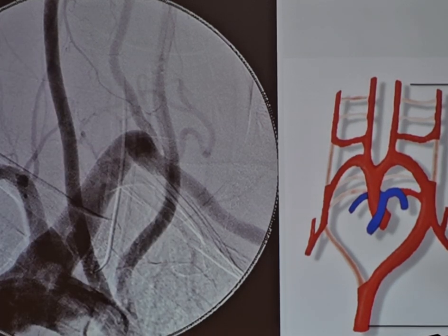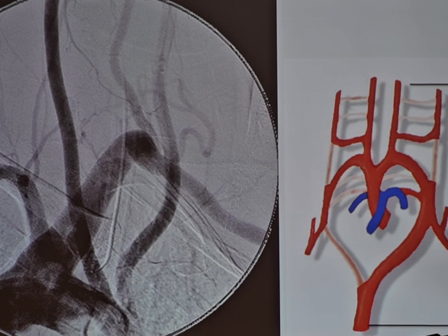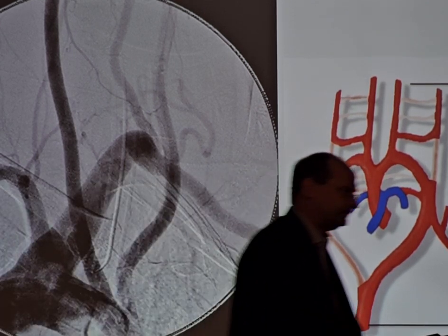A little bit of addition to the technique, as Timo said: we use a little bit more dilution when we reach that point, because you don't want any millimeter of reflux. Even withdrawing the catheter must be soft. As Timo said, in this very small artery, if you already have some glue at the tip, you probably need to be very cautious. Good points. So, two quick cases.